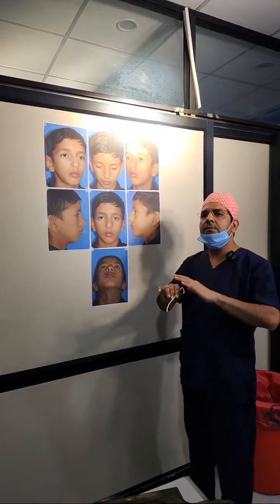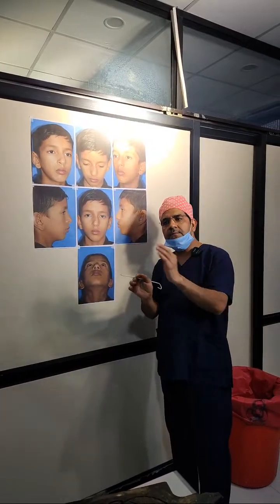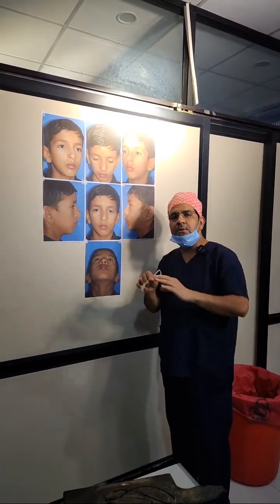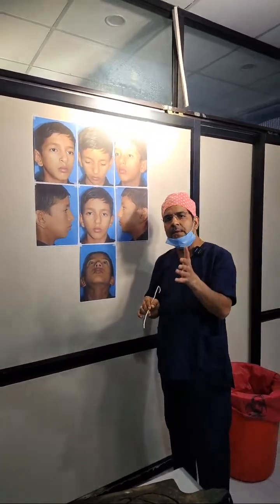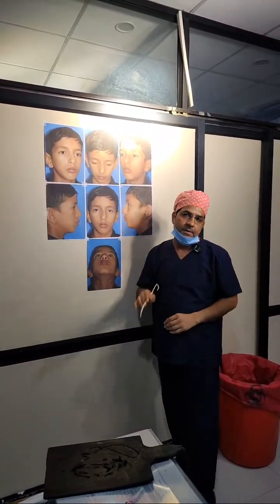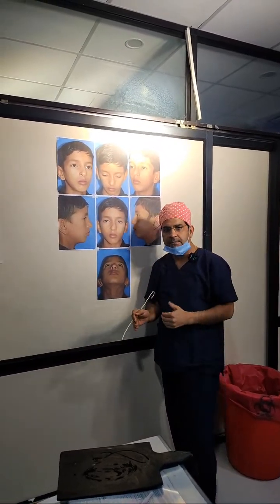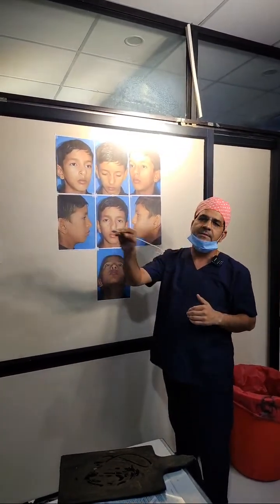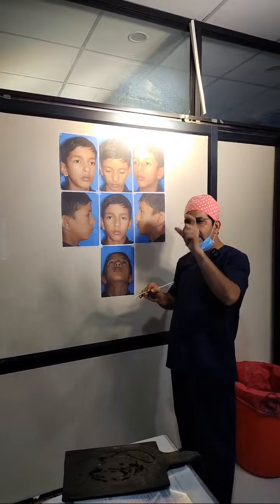First you completely deglove the mucoperichondrium from the septum. If one side is concave and the other is convex, then you first completely deglove the mucoperichondrium on the concave side. So at least you preserve your mucoperichondrium on one side, and then you lift the mucoperichondrium on the convex side. And if you have buckling or twisting of the septum, or a fracture, then first you remove the fractured part of the septum, and once you have completely exposed it, you again evaluate the septum.